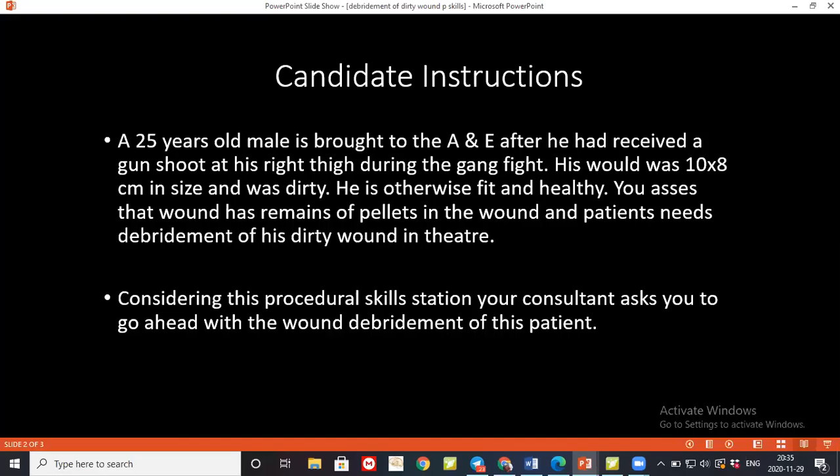I'll also prescribe analgesics for the patient and advise him to look for certain adverse effects: if he gets any fever, any wound discharge, or any redness around the wound, he should come immediately to his GP or to our hospital for consultation. After that, I'll dispose the sharp instruments and syringe in the sharps bin and dispose my gowns and gloves in the yellow clinical waste bin. Then I'll thank the patient.